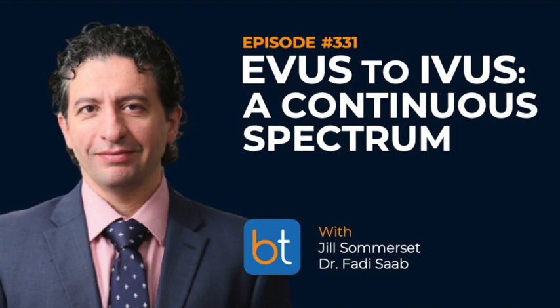I'm not exaggerating when I say there are more than 100 trials looking at intravascular ultrasound-guided percutaneous coronary intervention versus non-IVUS-guided interventions, and the difference is crystal clear.